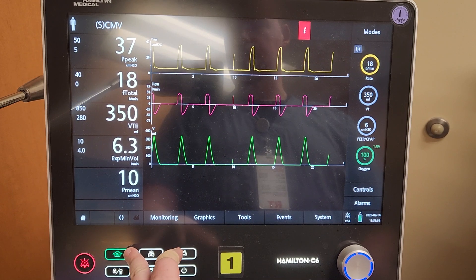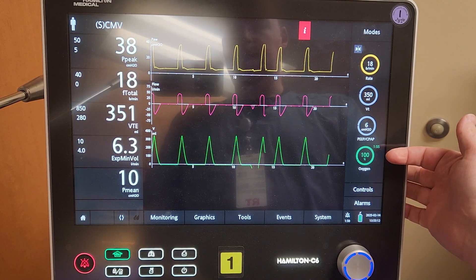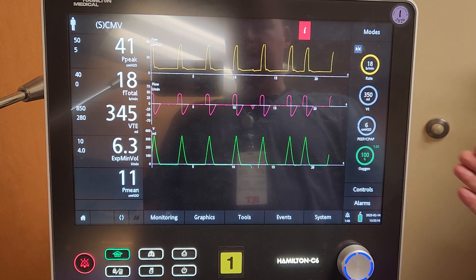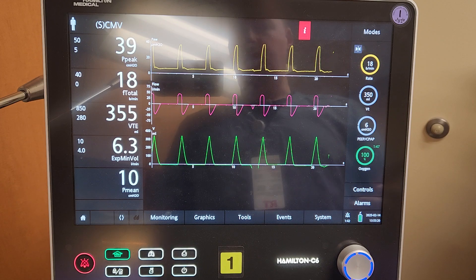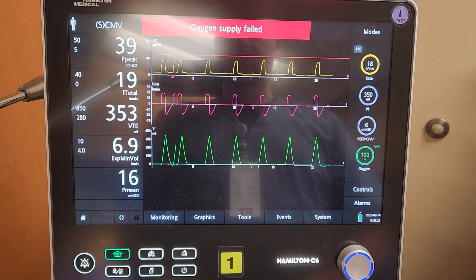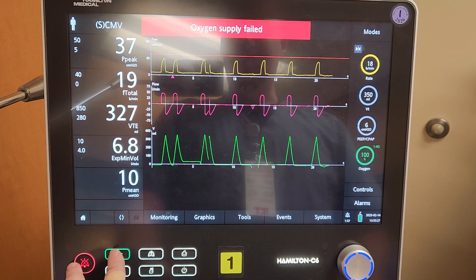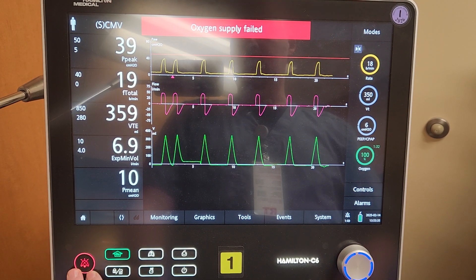Here you have an increase oxygen button. This will increase the oxygen to 100% for two minutes, after which it automatically drops back down. With this ventilator there is no dedicated suction button — instead we have to press the increase oxygen button and the alarm silence button together in order to achieve this.